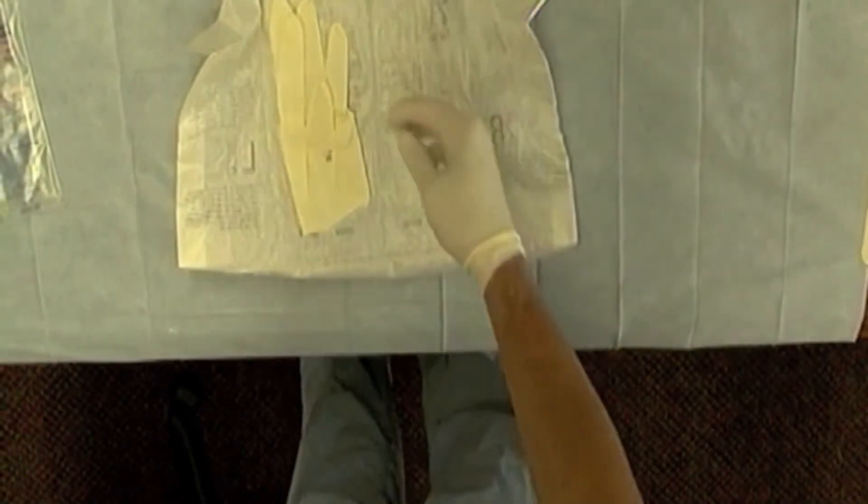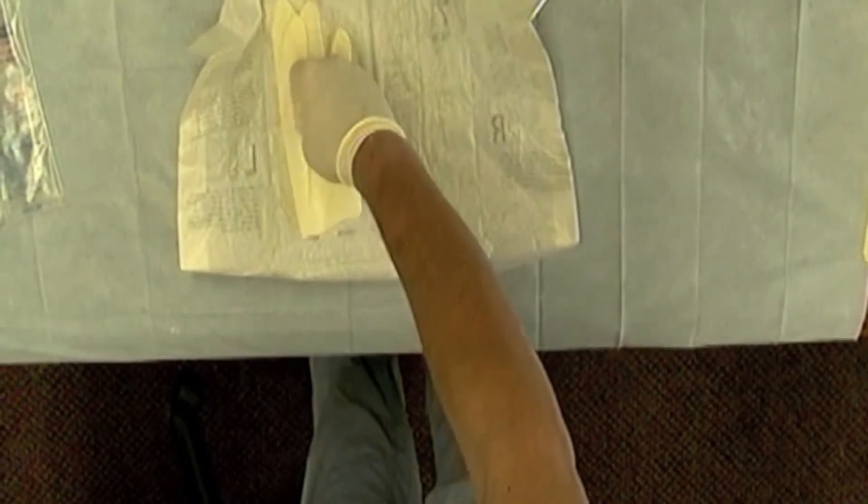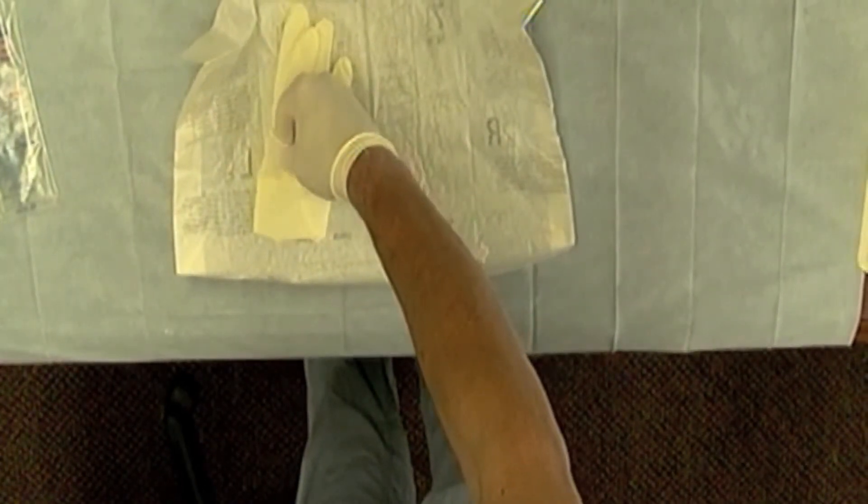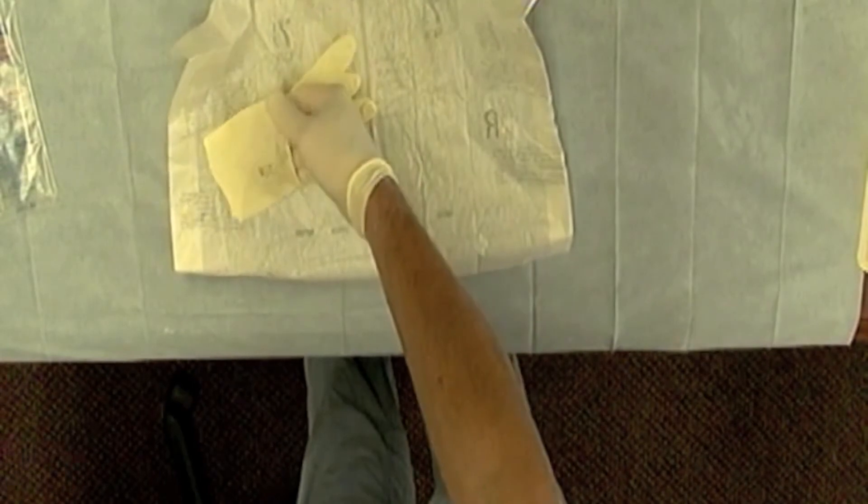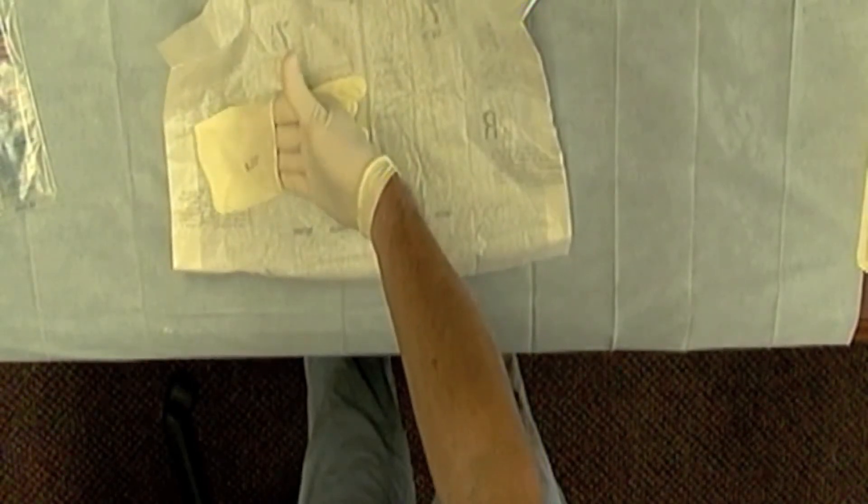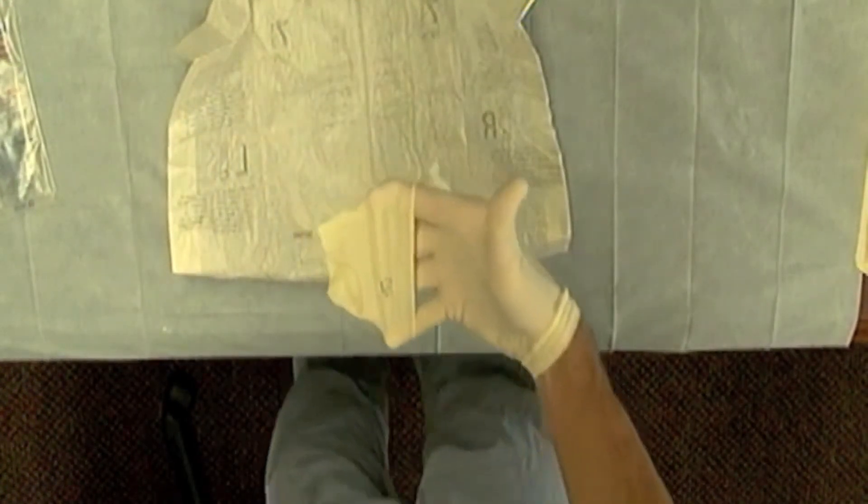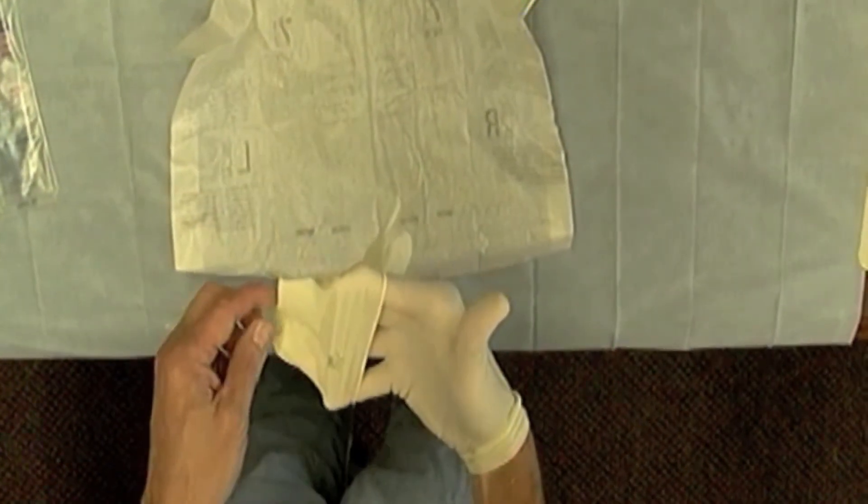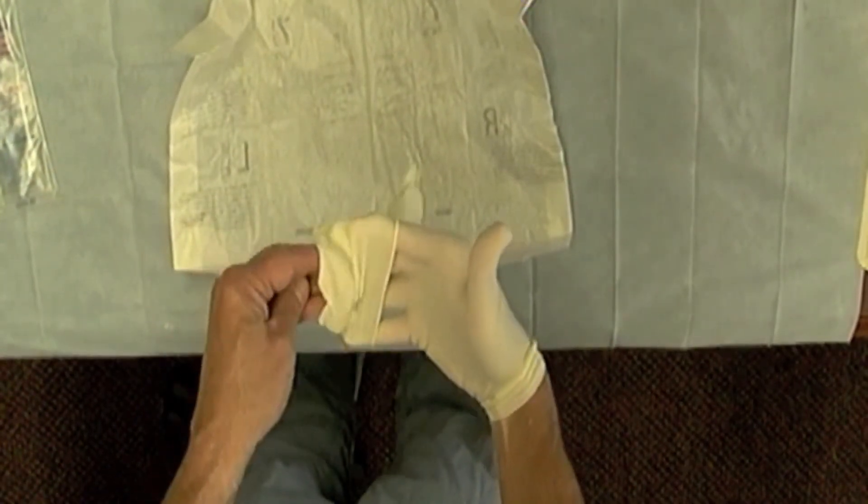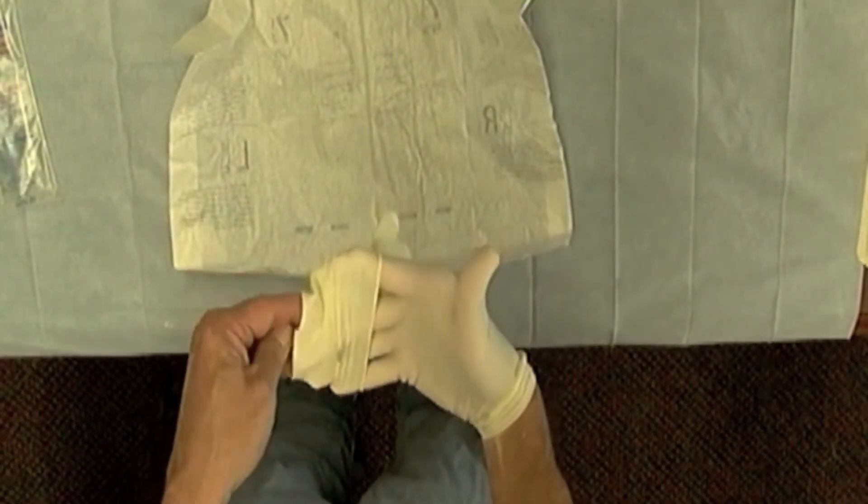Now I need to grasp the left glove, and I'm grasping it on the inside aspect of the cuff, which is the sterile portion, making sure that I spread this liberally in order to get my left hand into the glove.